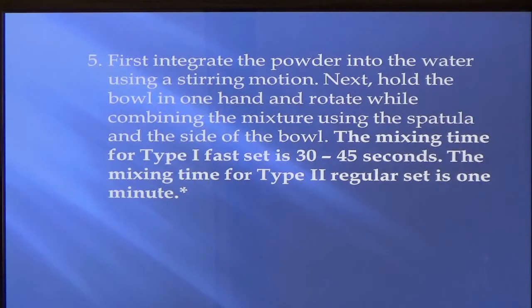That's on the test. So the mixing time for type 1 fast set is 30 to 45 seconds. But I'd stay more to 30, because if you wait too long, it's going to be too late. It's going to set up on you. I'd probably go 15 to 30.